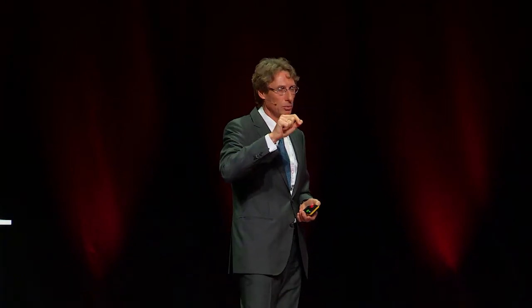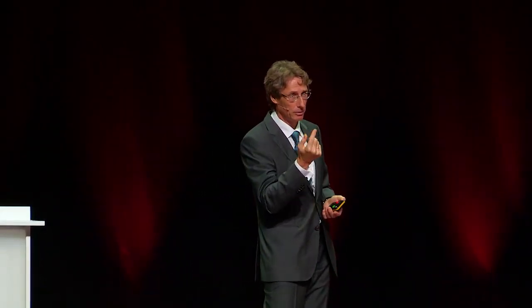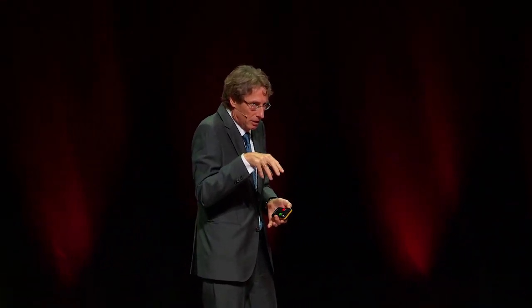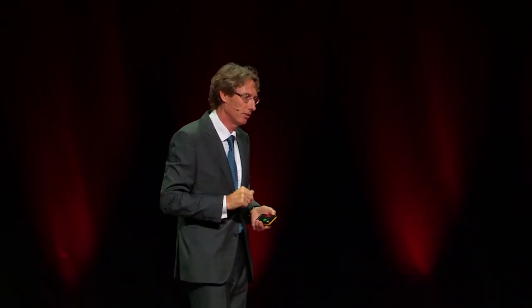So if we have to get it away, it's easy because with the diamond burr we can touch the PEEK, but with refrigeration we will not burn it, we will not hurt it, and then we have a really nice canal to get down to the screw, especially if we have long canals. If people with hybrid prosthesis come to our office, it's sometimes really incredible. The difficult thing is to find the screw in the acrylics.